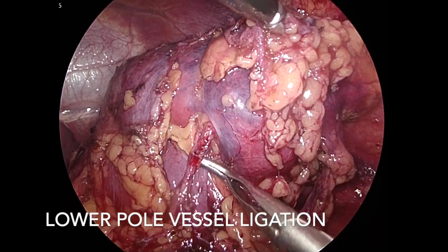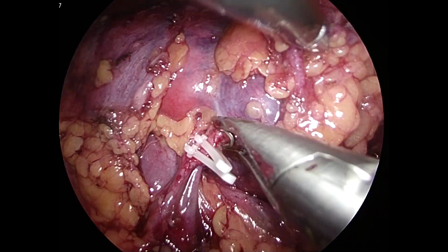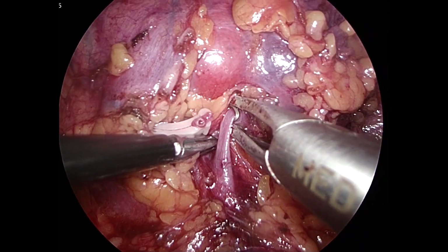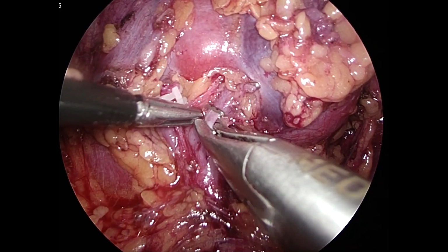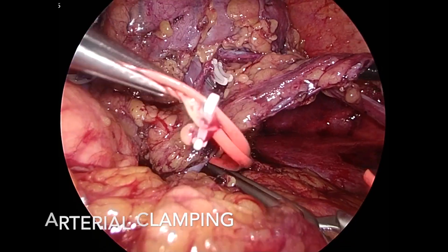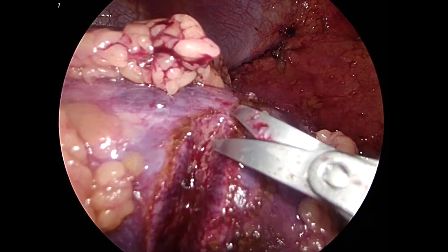Intrahilar dissection of the lower polar vessels, as identified on the CT, was done. They were separately ligated and cut. After this, the main renal artery was clamped and tumor resection was started. Care was taken not to enter into the tumor.